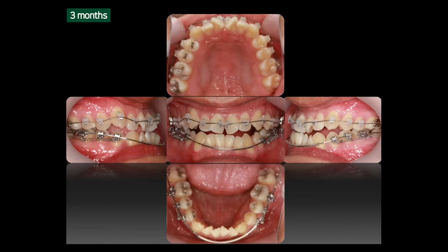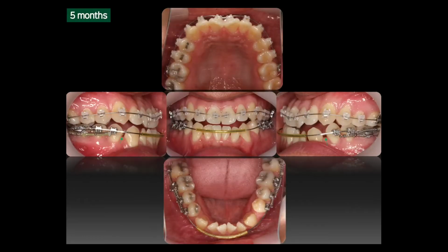At 3 months of treatment, the mandibular premolars were distalized on the stainless steel arch wire using nickel-titanium closed-coil springs. Brackets were not bonded on the mandibular anterior teeth to avoid flaring during alignment. At 5 months of treatment, spaces developed mesial and distal to the mandibular canines.